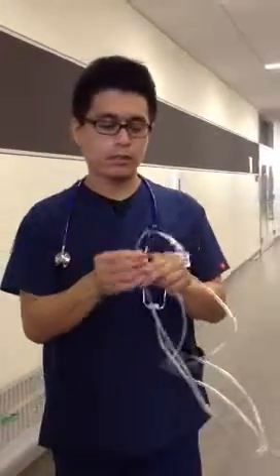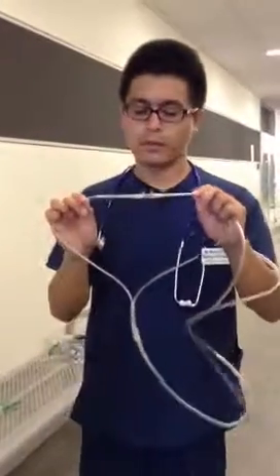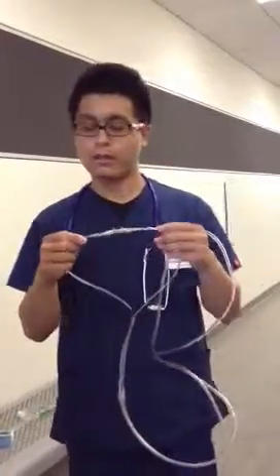Okay, anyway. Just go with it. Lower this a little bit, all the way down. You want to put the prongs facing downward into the patient's nose, around the ears, under the neck, and then you make sure you fasten it back up. And then you have to ask, does that feel okay, Mr. Cartman? If not, readjust it. What about now? You still complain, oh, it feels weird. Well, I'm sorry, but you know, this is what is going to give you oxygen.